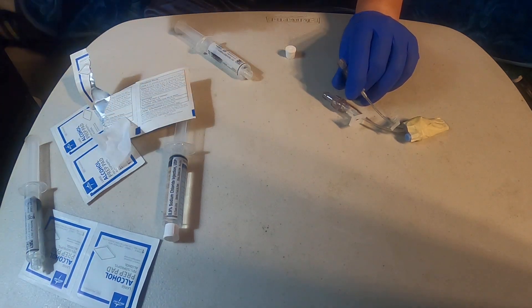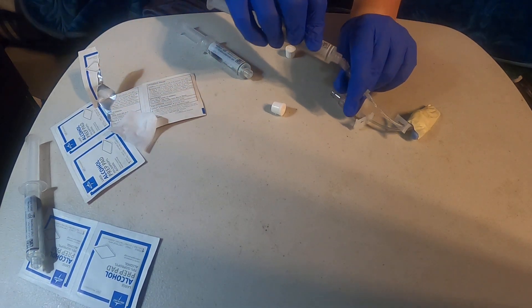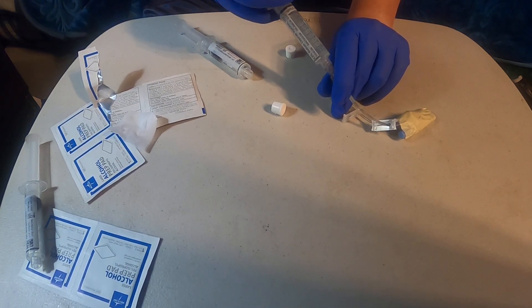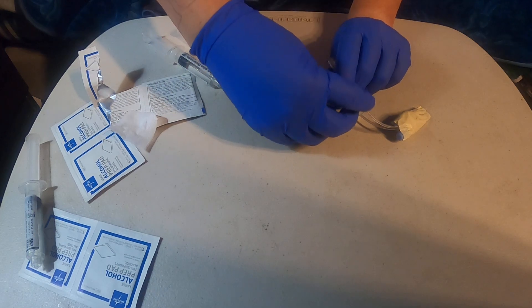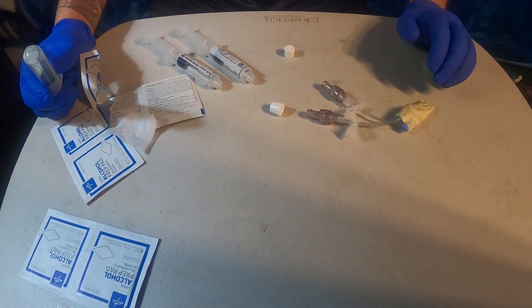Following that, you're going to get a new flush of normal saline, attach it, and then slowly pump 10mls into the catheter. Once it's filled up all the way, you detach it, get the clamp, and clamp it up.